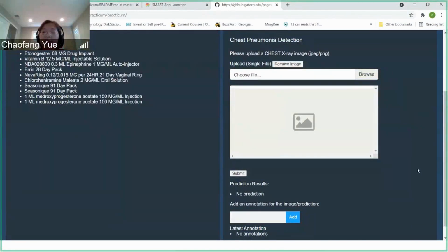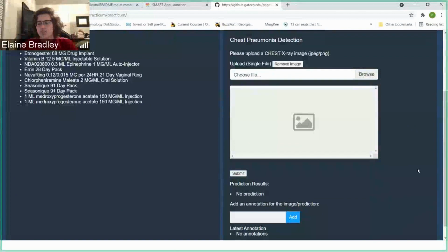And then James, if you want to talk about how we are interfacing with the machine learning model through our application here. Once a provider uploads an X-ray image to our portal, the front end makes two requests to receive a prediction from the machine learning model that we built. The first request processes the image uploaded by the provider and uploads that image to a public S3 bucket. In a real-world application, we wouldn't make this bucket public. To keep the project configuration simple, we've allowed public access to the bucket.